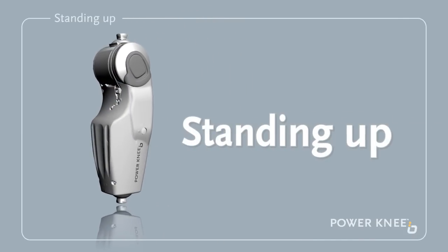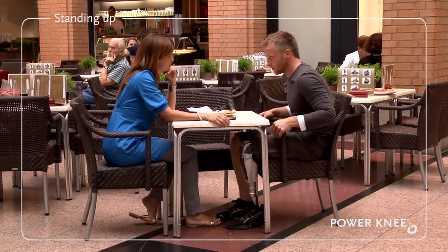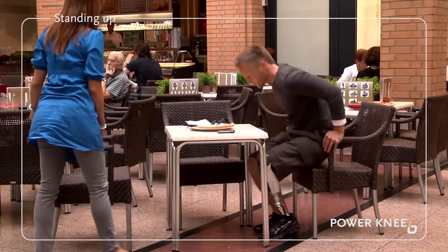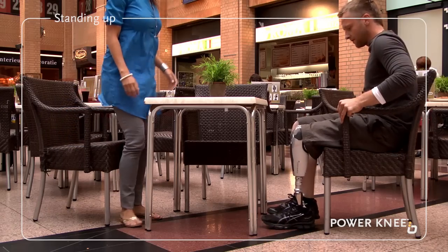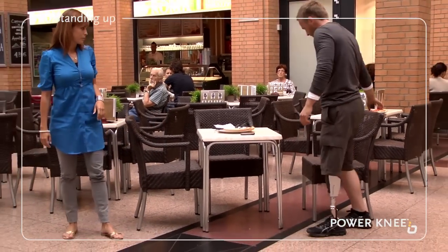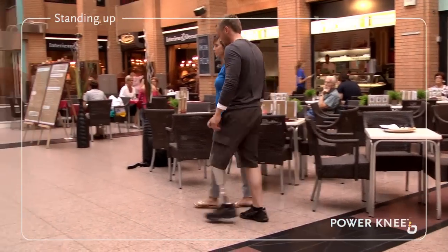Standing up. When you are ready to get up again, you will need to place your weight evenly on both your sound leg and the prosthesis. Lean forward slightly and you will be able to initiate the Power Knee's stand-up movement by putting some weight on the knee. This movement helps to give you a lift as you stand up.